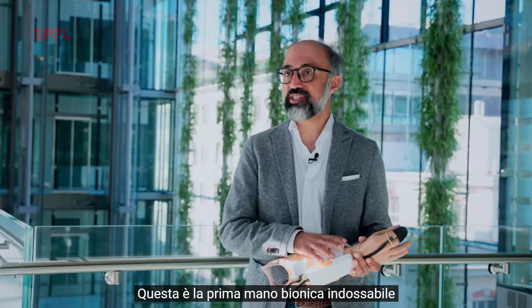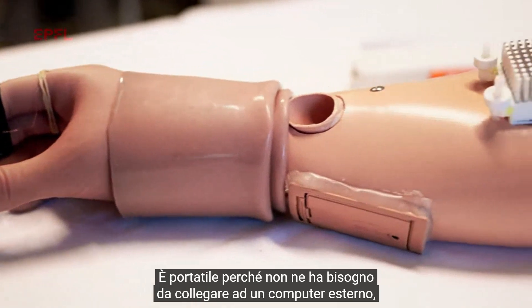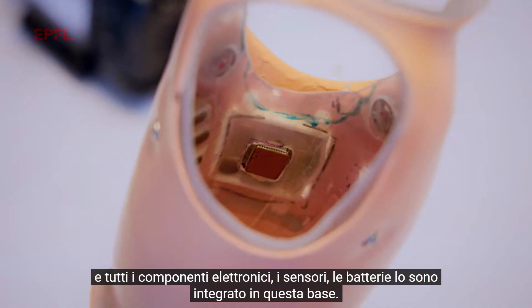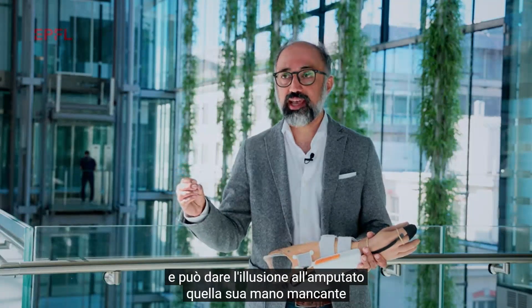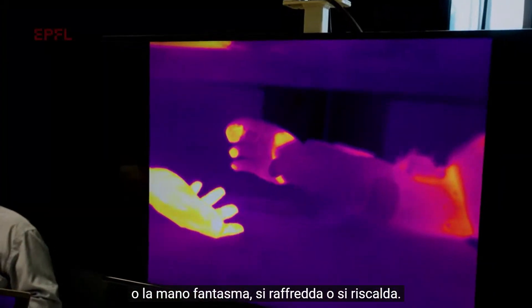This is the first wearable bionic hand which allows amputees to feel temperature in their phantom hands. It is wearable because it doesn't need to be connected to an external computer, and all the electronics, sensors, and batteries are integrated into this socket. It is bionic because it communicates with the nervous system of the subject and can give the amputee the illusion that the missing hand — the phantom hand — is cooling down or warming up.